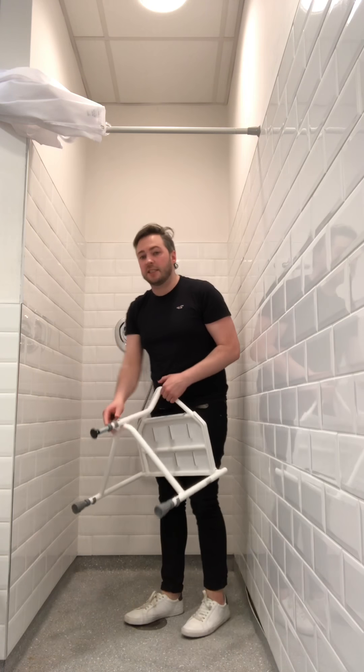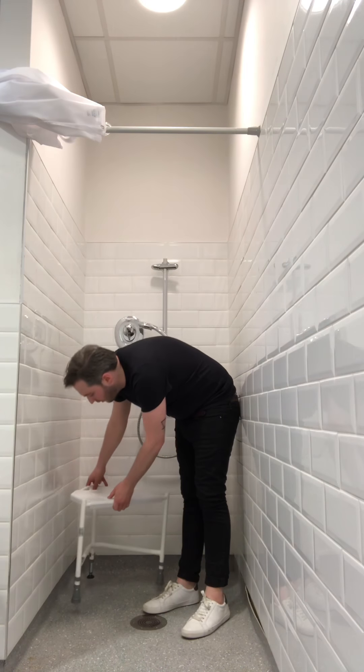If you're having any difficulty with the setup of any of these pieces of equipment, or you have any questions about how to use them, contact your local occupational therapist. They can speak with you on the phone, send you information, or come out and show you how to use the equipment. Thank you very much.